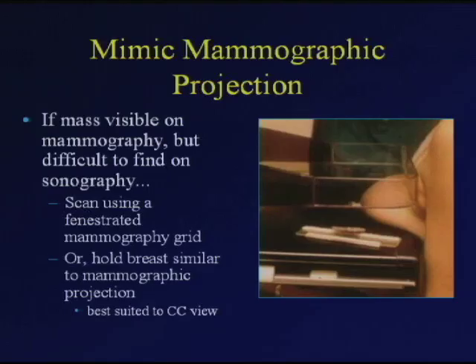Now, occasionally you might want to mimic the mammographic projection. This generally works best in the CC projection because you can hold the patient's breast in your hand. You can measure from the nipple how far back and how far lateral or medial the mass may be.